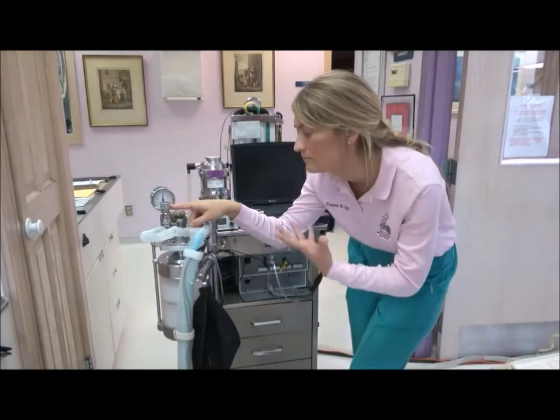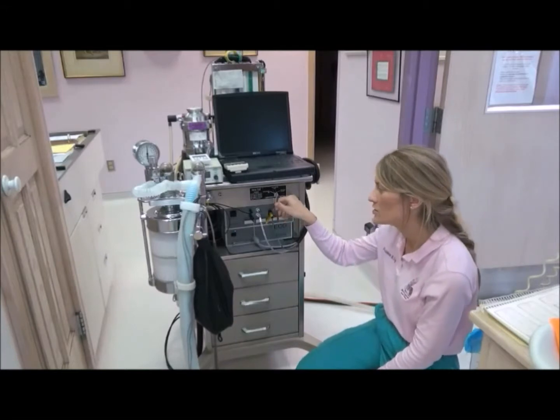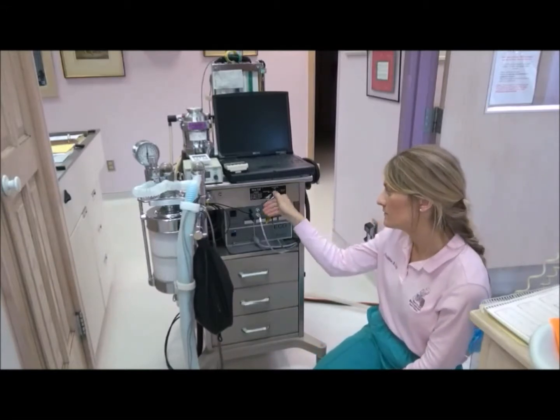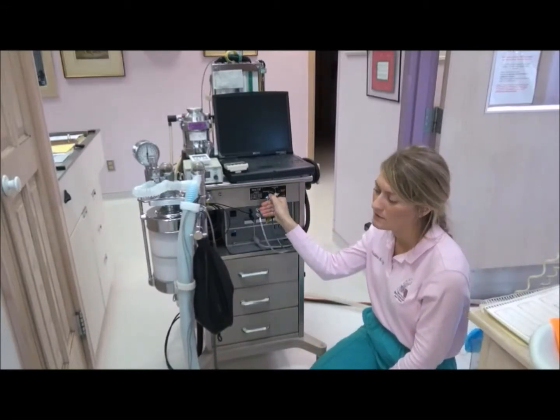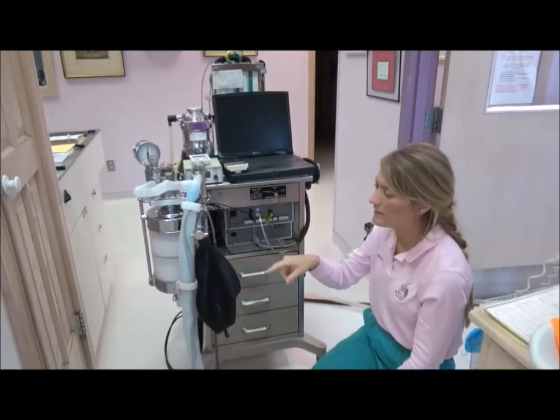And when an animal is breathing spontaneously, the numbers here on the gauge should read between 0 and 2 centimeters of H2O. This lever here, this is the oxygen flush lever. So if you turn that on, it's going to rapidly deliver a large amount of oxygen to the reservoir bag here.